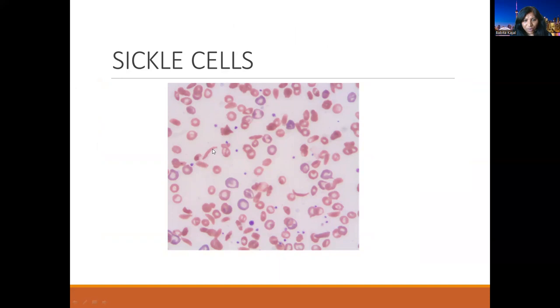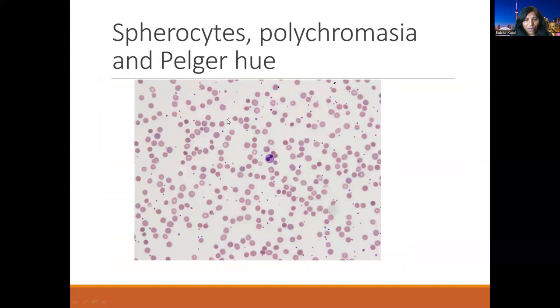These are sickle cells with polychromasia and sickling. Here you can see all those cells — they have a half-moon shape, typical of sickle cells. And here again, those cells are small and do not have any central pallor compared to a normal RBC. With a majority of polychromatic cells, slightly increased platelets, and a neutrophil showing only two lobes, this is spherocytes with polychromasia and hyposegmentation — some kind of MDS or hemolysis.